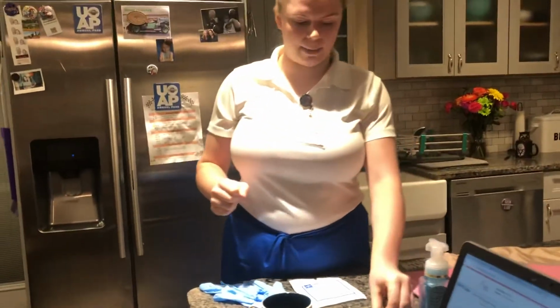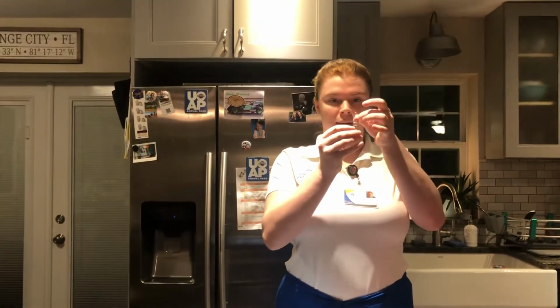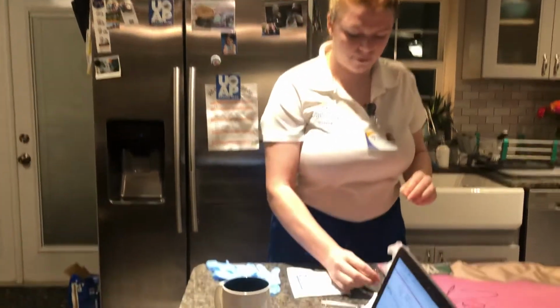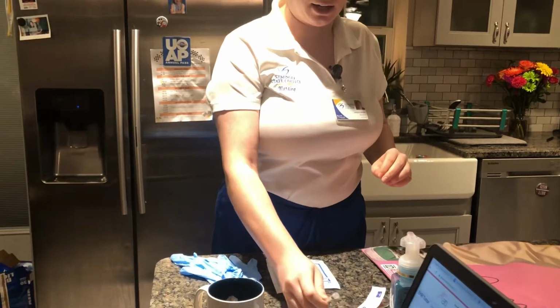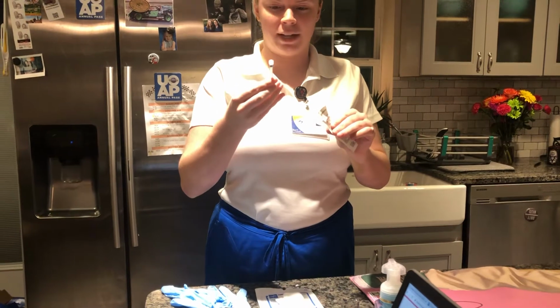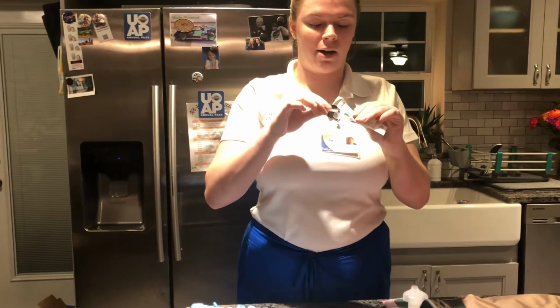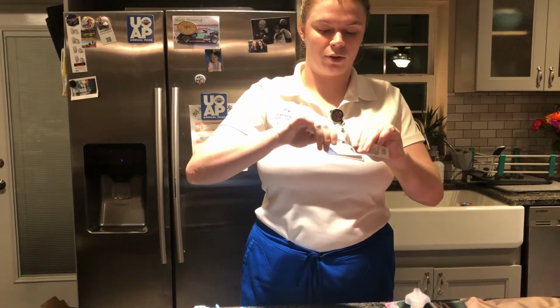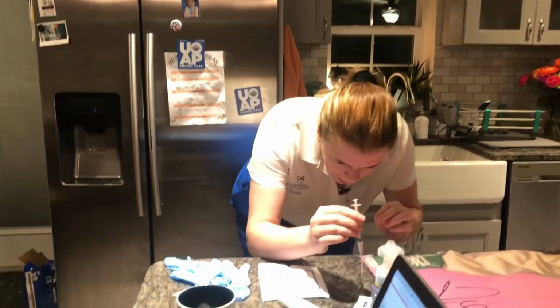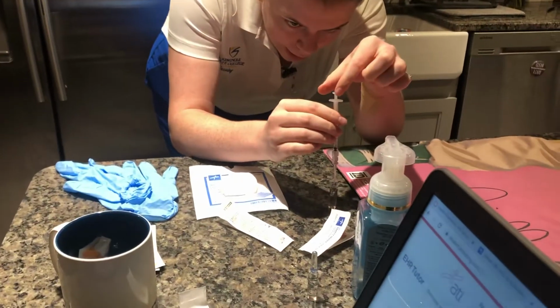So we're gonna get my ampule, we're gonna tap and make sure there's no liquid in the neck. Good to go. I'm gonna be breaking this away from my body at the little divot there. Okay, I'm gonna get rid of that in the sharps container. I'm gonna place this on a flat surface. I'm gonna be attaching my syringe to the filter straw without contaminating the plunger or the filter straw. Pull that out. We are going to go ahead and put that in here. Again, not contaminating the plunger.